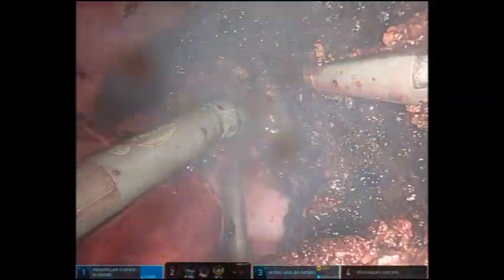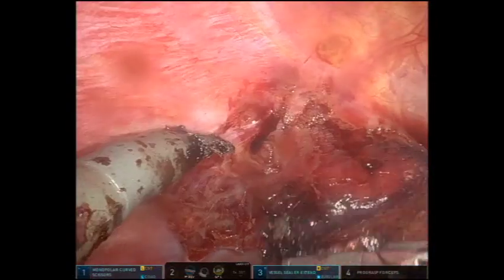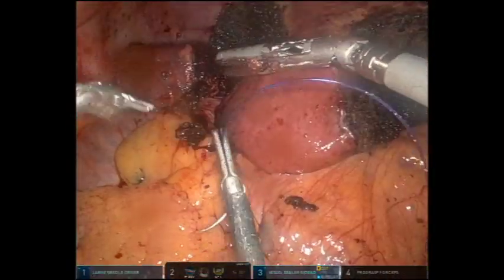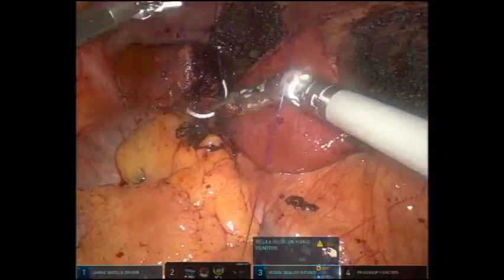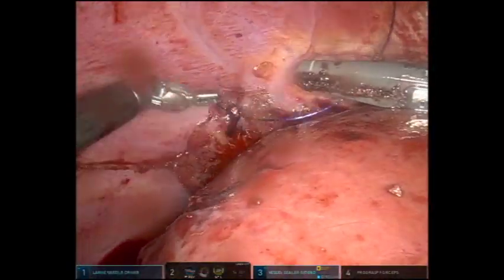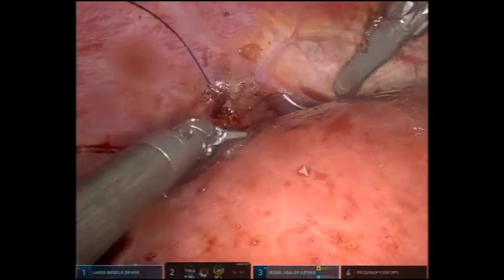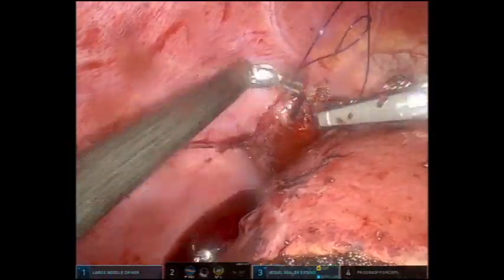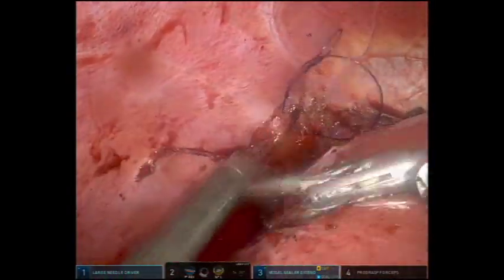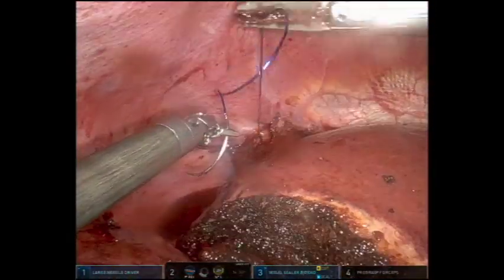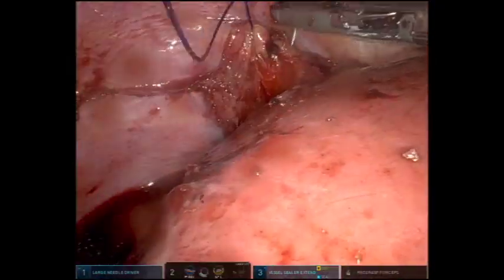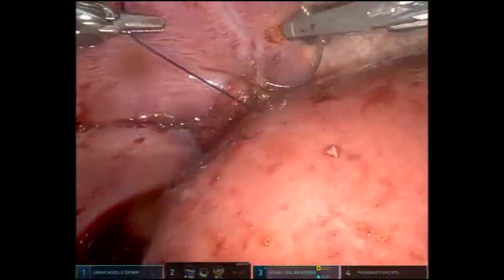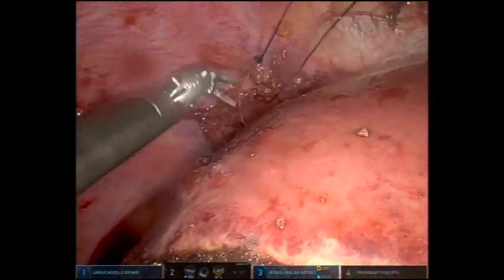A small defect had been noted in the diaphragm. A barbed suture was introduced into the abdomen. Utilizing a robotic needle driver as well as the vessel sealer, the defect was closed in a running fashion using the barbed suture.